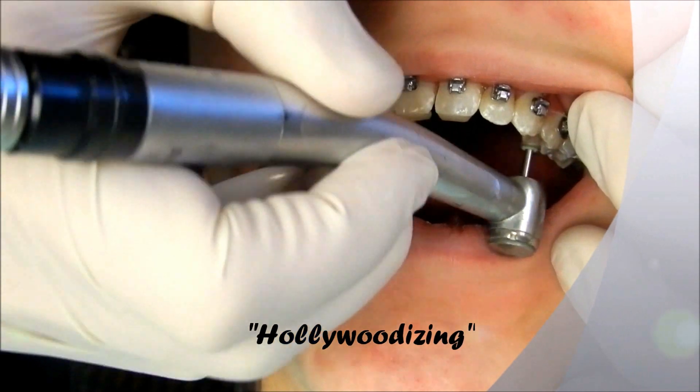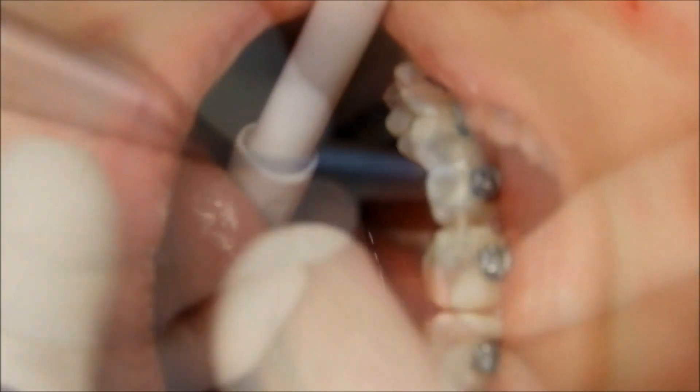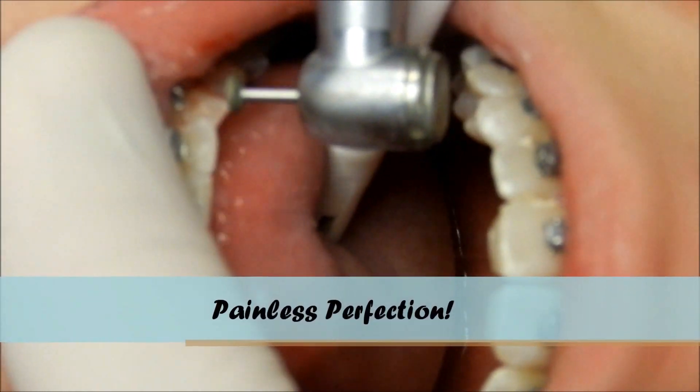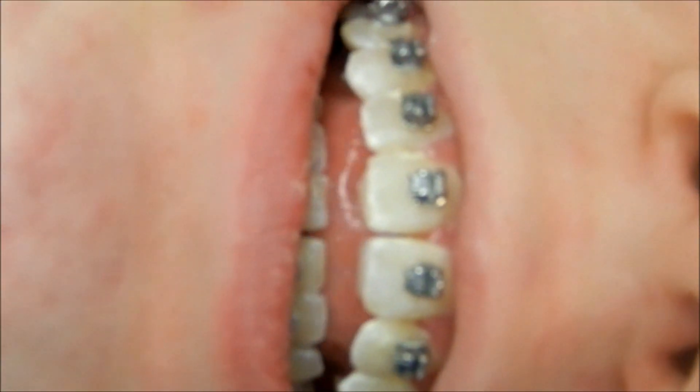You can see as I polish it off how that makes the teeth look more rounded. I'm not taking a whole bunch off, just a little bit. Open. That makes the teeth look more mature. Did we give you a shot to numb you up? Are you sure? Pretty sure we didn't give you a shot. Oh, 100%.